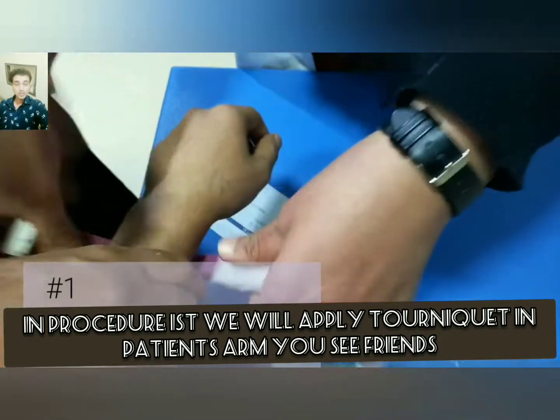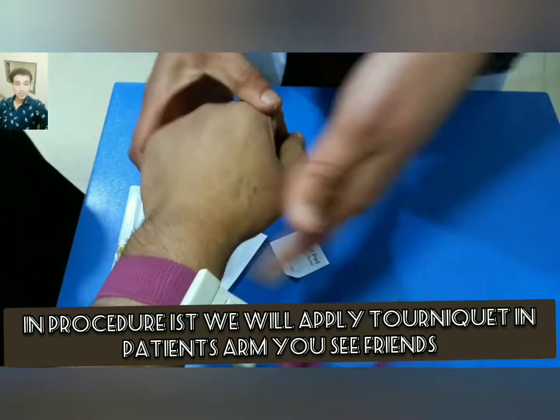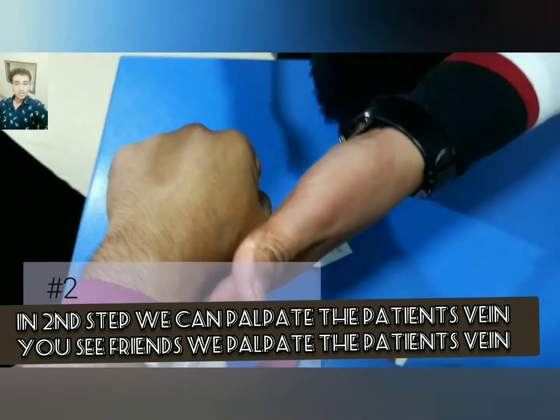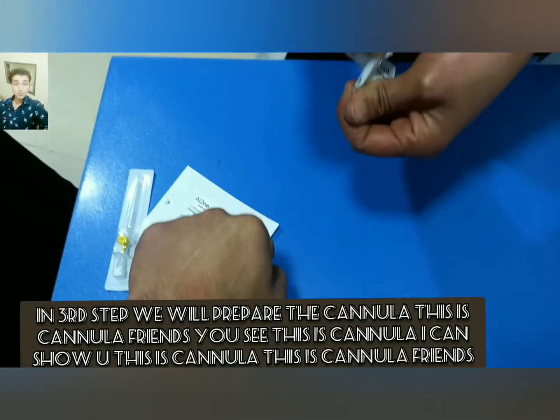In the procedure, first we will apply the tourniquet to the patient's arm. In the second step, we can palpate the patient's vein.